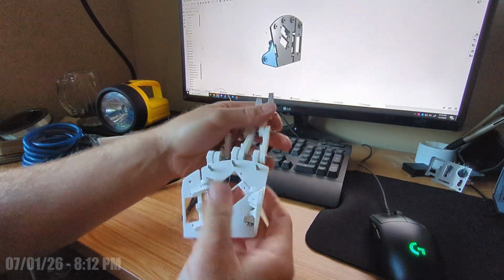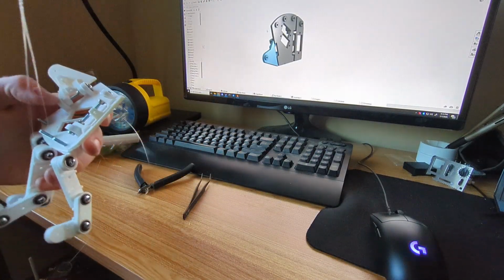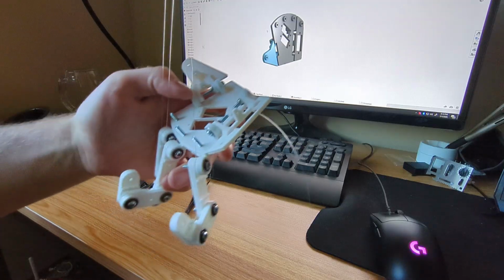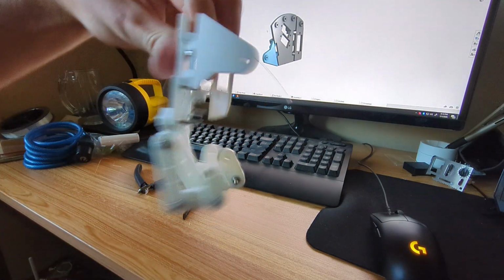Print finished, and I assembled it, wired it all up. I went and picked up some fishing line, and that's currently serving as the tendons. And here we are.